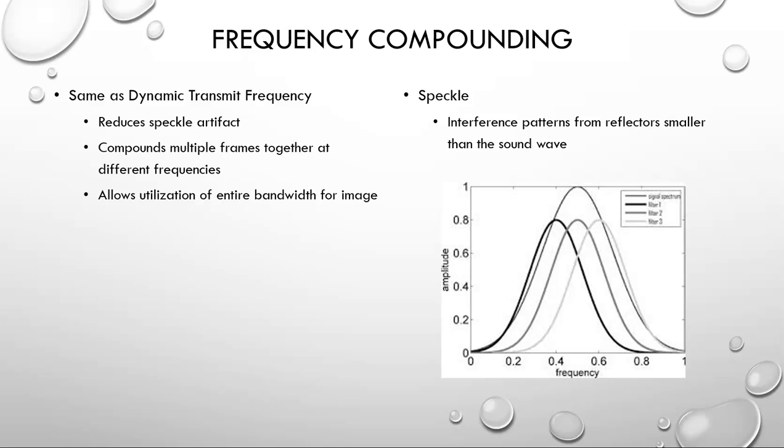I said this reduces the speckle artifact. Well, I better explain exactly what the speckle artifact is, because this question has been known to show up on the SPI exam. Speckle is interference patterns from reflectors smaller than the sound wave.